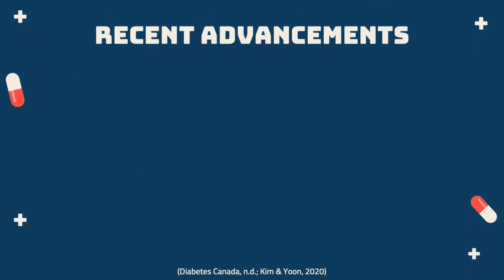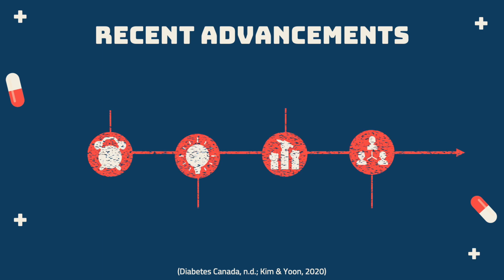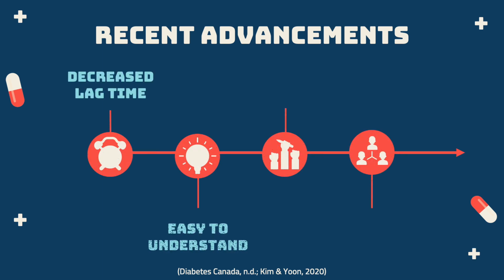Advancements in continuous glucose monitoring technology now allow users to receive blood glucose levels directly to their monitors in near real time. Many monitors display numbers and graphics that are easy to read and interpret. The user follows the information on the device to maintain target glucose levels. In some cases, the device will advise the user to verify the reading with a finger stick.